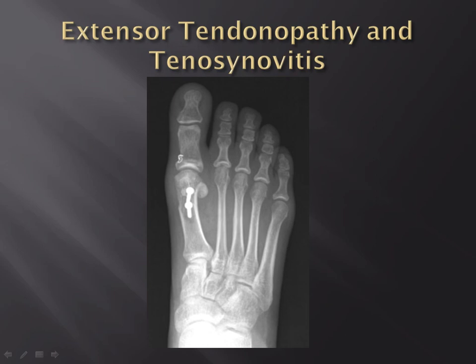This is a patient, I don't remember her age, she was a senior airman, fairly active, who had a bunion surgery that was repaired, and this is her post-operatively. Now, her foot doesn't look like this anymore. She has since had all of the hardware removed because her surgery was complicated by an iatrogenic tendinopathy with a resultant extensor hallucis longus tendon rupture from one of the metatarsal screws being somewhat proud, which caused an impingement on the tendon and a resultant rupture.